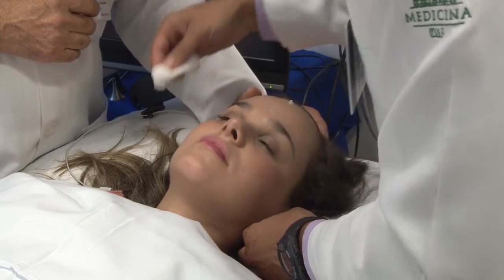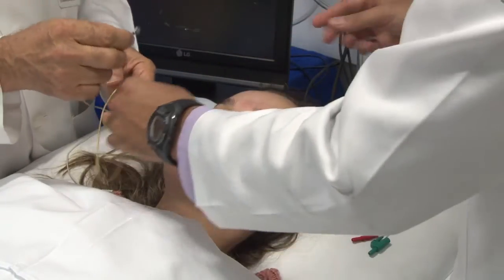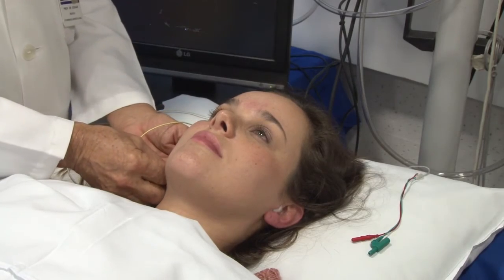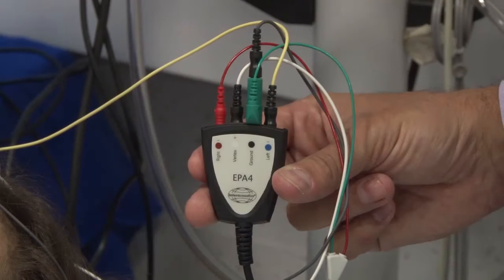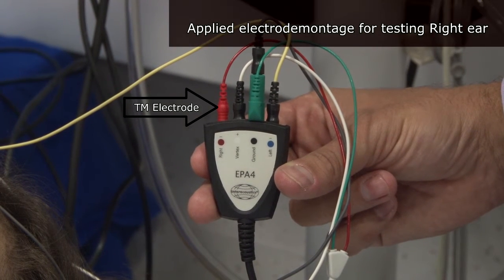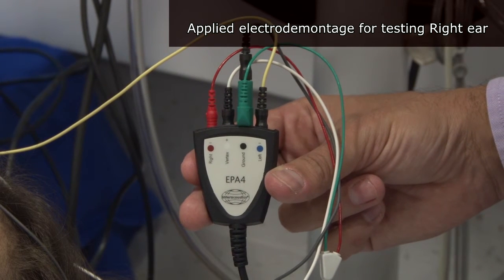Meanwhile, we will prepare the skin and fix the surface electrodes using contact cream. This is the way we put the electrodes into the pre-amplifier. For the right ear, the jump is placed into the right socket and ground. The right earlobe electrode is connected with the blue socket and the forehead electrode is plugged into the white socket.